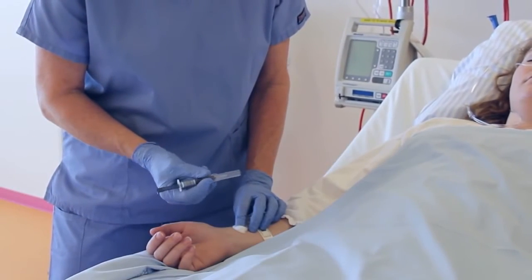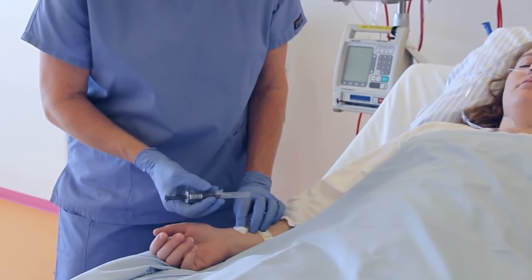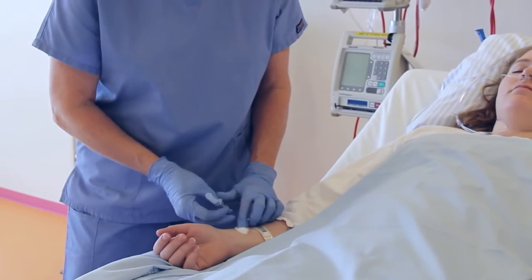Withdraw the needle and apply pressure to the puncture site. Remove the needle using a safety device.